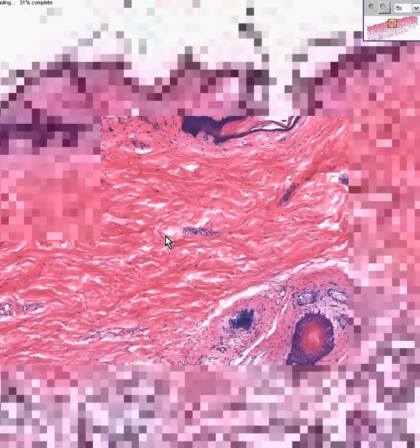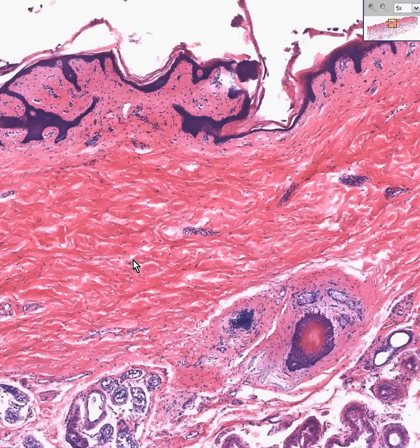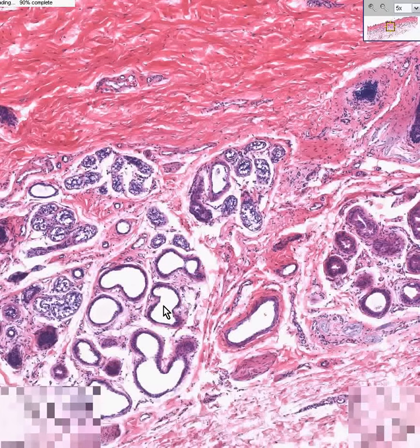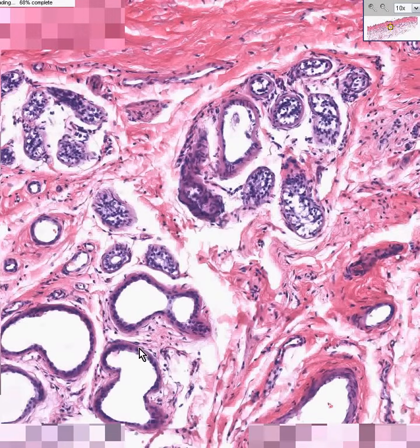Let's look at the types of sweat glands that we didn't see before. Whereas we saw these eccrine sweat glands, which we said were basically small tubules and ducts, this being a duct and this being an acinus, or the secretion part of the gland. The apocrine sweat glands, like you see here, are much larger and more irregular. And of course, these are not blood vessels, because when you go down on them, you can see that they are lined with true epithelium, like you see here, and not endothelium.